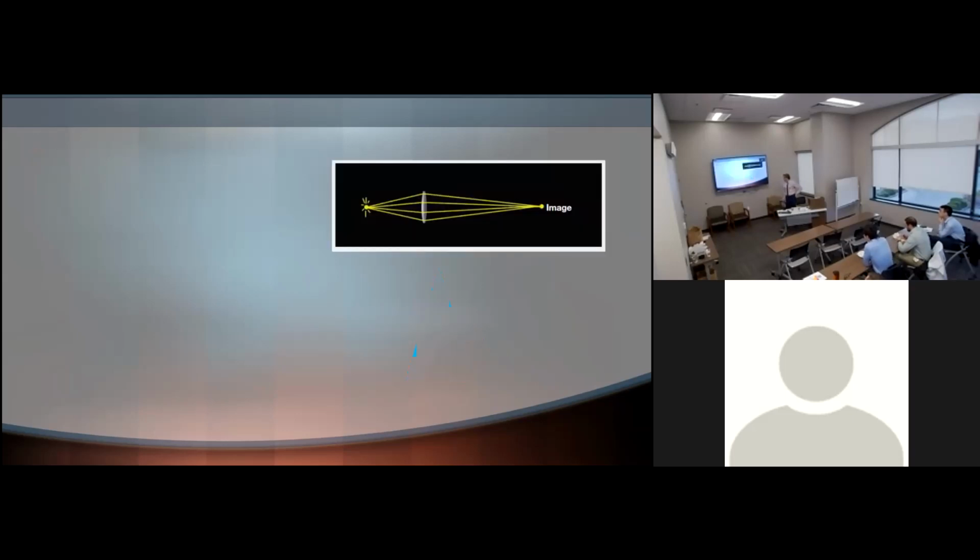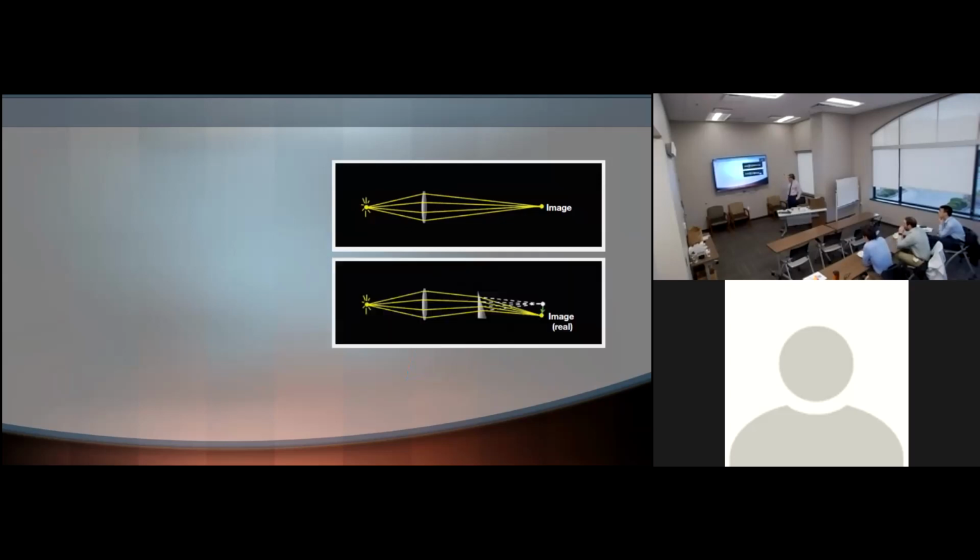Okay, so this is an example of an image formed, and then when you introduce the prism in the way, the light rays will bend toward the base. So light bends toward the base. Think about blink to light. When you check kids, BTL: base, blink to light, or light bends toward the base. Just like with mnemonics, you understand first and then memorize it. Okay.